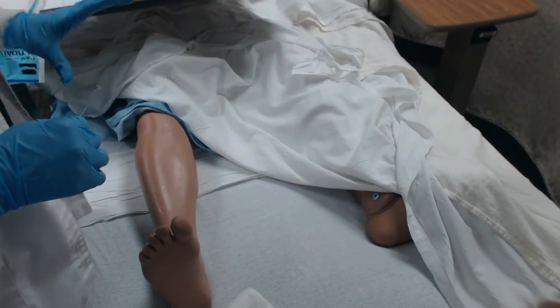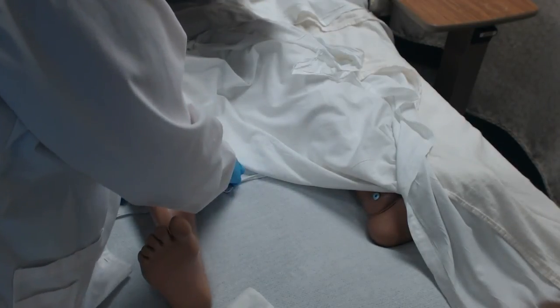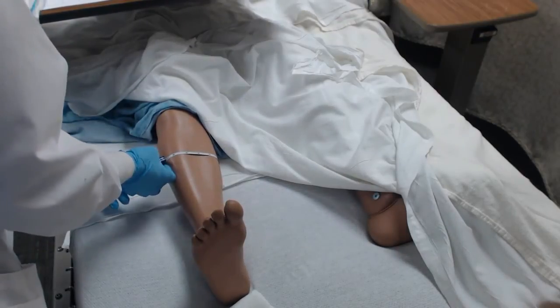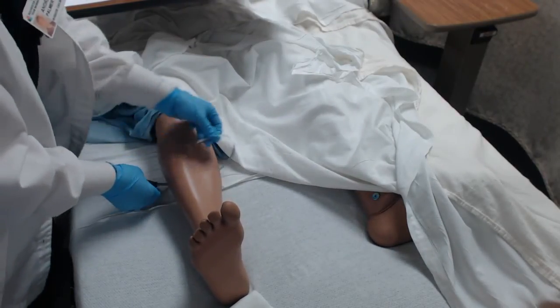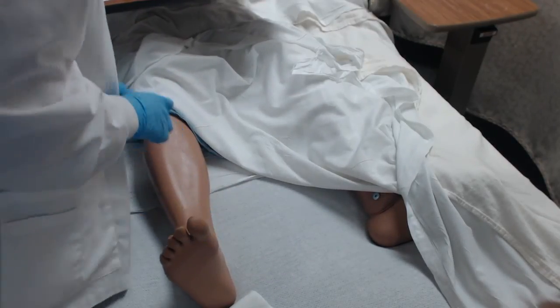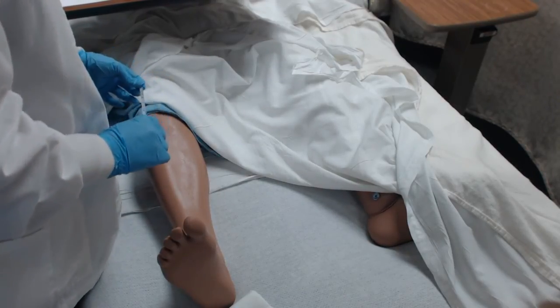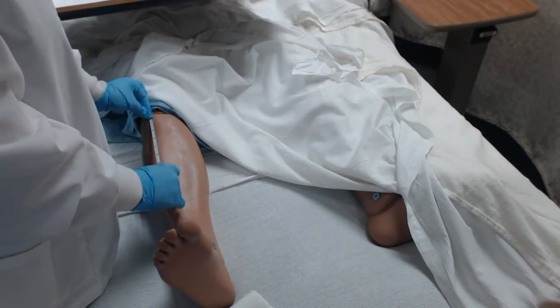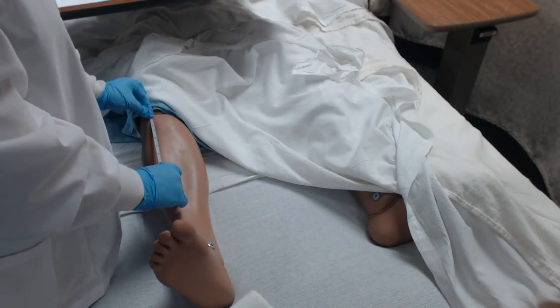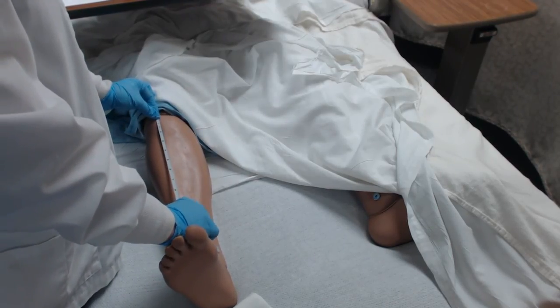What you need to first measure is the widest part of the calf. So I would wrap this around. This becomes hard because Miss Potts does not bend her legs. But I would then measure, okay, I got 14 inches. Then I'm going to measure the length. I want to start under the knee. Remember, we don't want it to go over the knee, all the way down the leg. And that's going to give me my length.